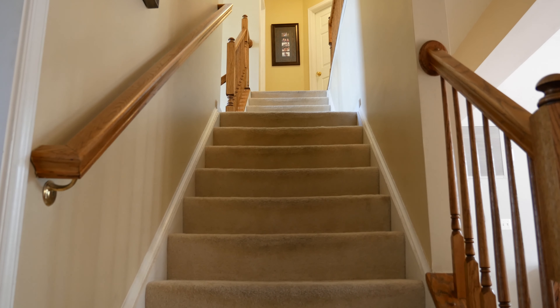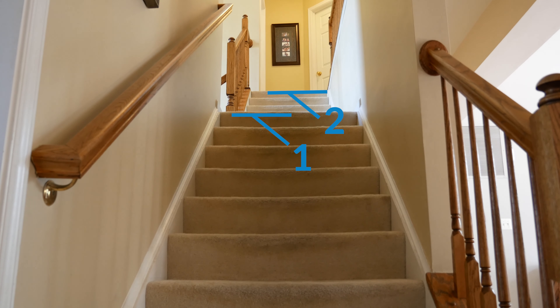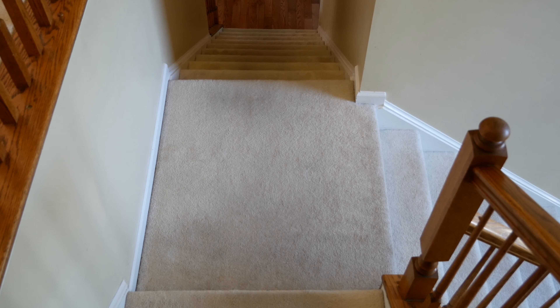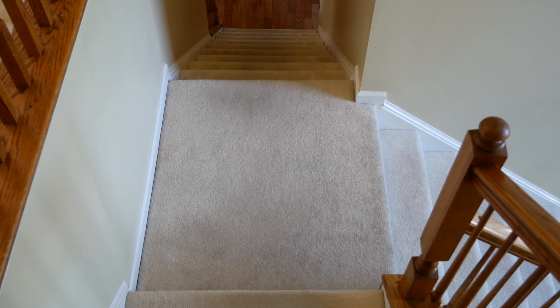Next, decide how many floors you need the stair lift for. If you have a landing, that counts as a floor.